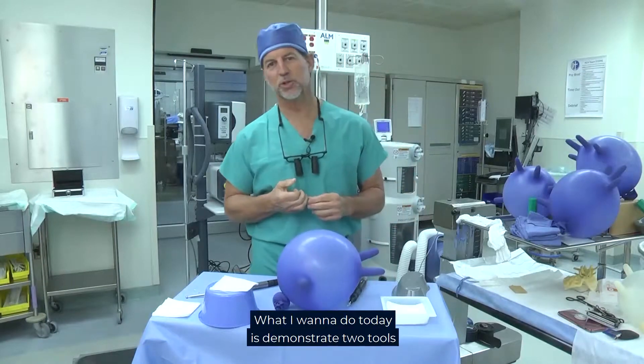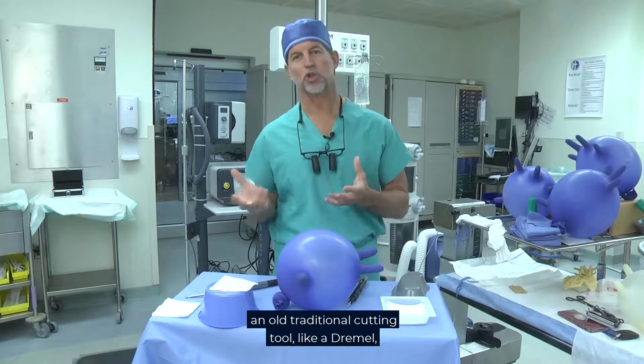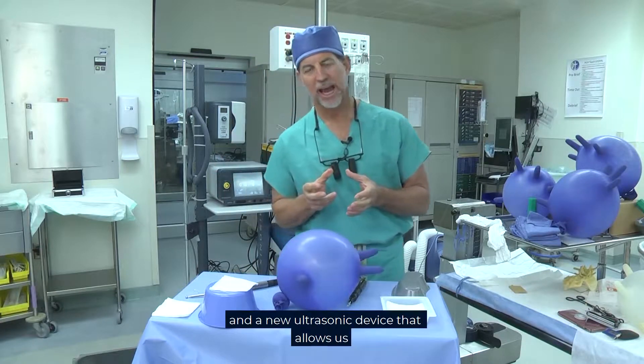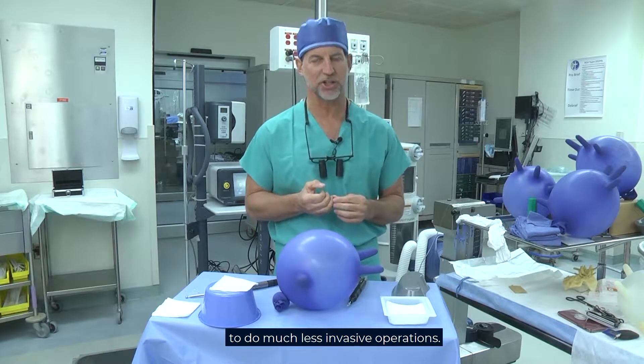Hi, I'm Dr. Kanter. What I want to do today is demonstrate two tools that we use in spinal surgery: an old traditional cutting tool like a Dremel that uses a very fast spinning blade to cut bone, and a new ultrasonic device that allows us to do much less invasive operations.